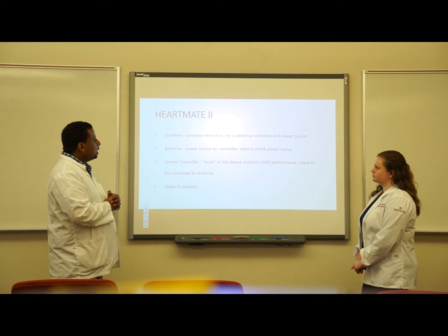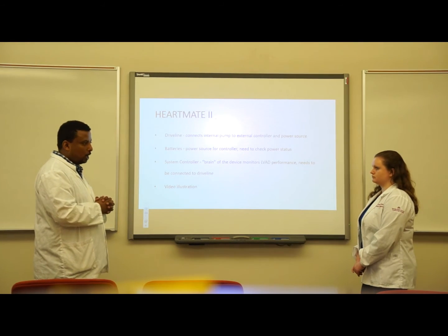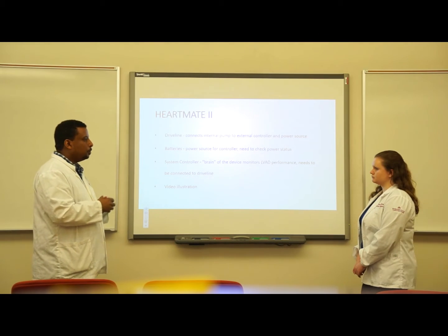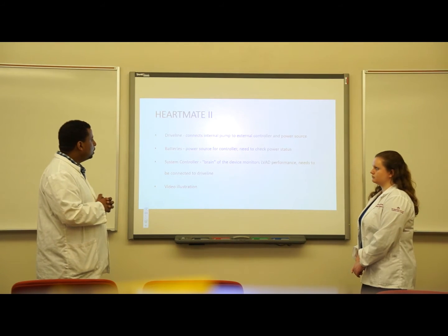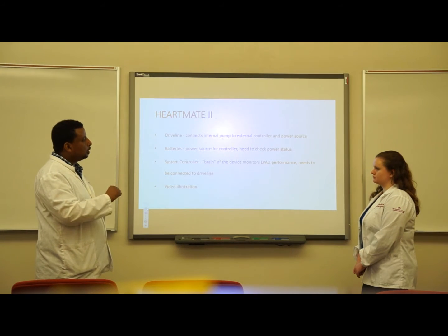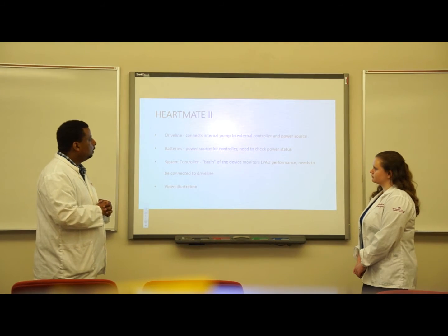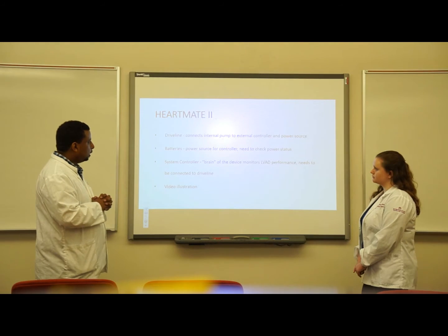Here we just picked the HeartMate 2. That happens to be the widely used one. We have seen it in our Abington Hospital care for the patients. So this particular device has a drive line which connects the internal pump to the external controller and power source. It has batteries for the controller. Okay, so we have to check the status.